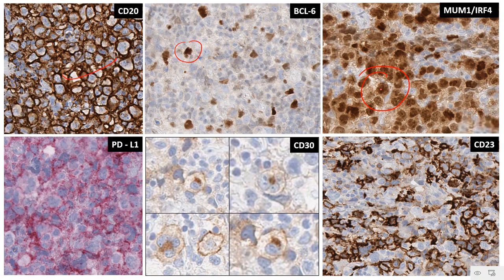And now in the lower row are a few markers, use of which is very important in order to diagnose a primary mediastinal large B-cell lymphoma. So for example, these markers like CD30 and CD23 should be used as a part of your panel, because if they are positive, they would help to substantiate your diagnosis of a primary mediastinal large B-cell lymphoma. Observe that CD30 seems to be positive in some of these atypical large cells, a few of which look like the classic Hodgkin-Reed-Sternberg cell, right? They've got the same pattern of expressivity in the membrane as well as in the Golgi zone. However, the staining is heterogeneous and weak, not really as strong as you see in the case of classic Hodgkin lymphoma.